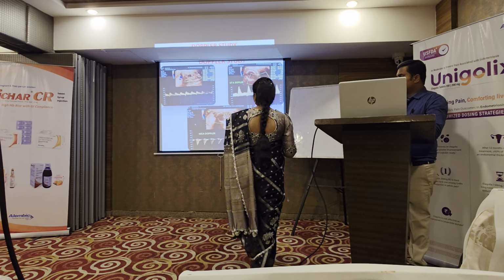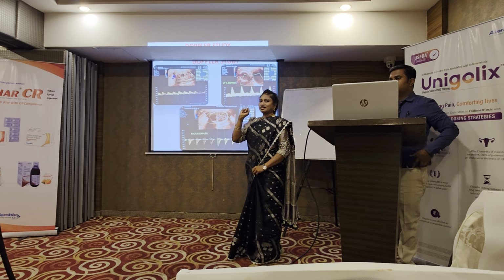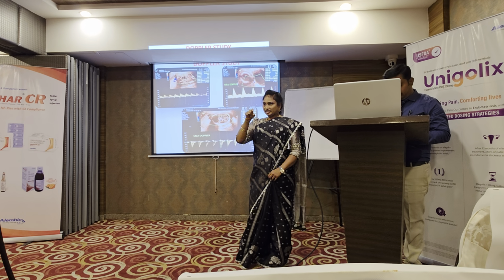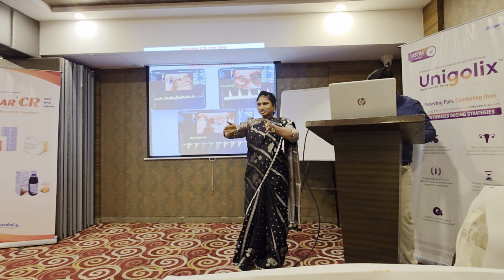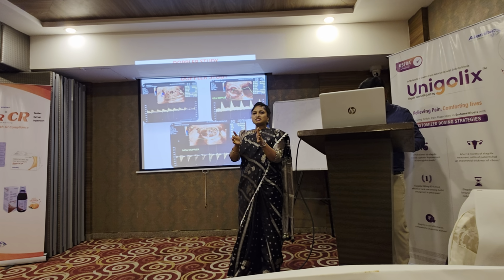First of all, you have to do umbilical artery Doppler, which is very important. So, which is the right place to do the umbilical artery Doppler? Either the free cord or around the bladder. Around the bladder, it is better because the baby is stable.